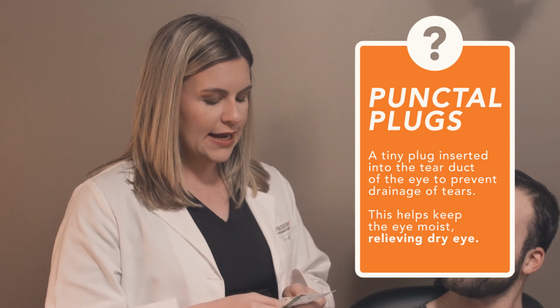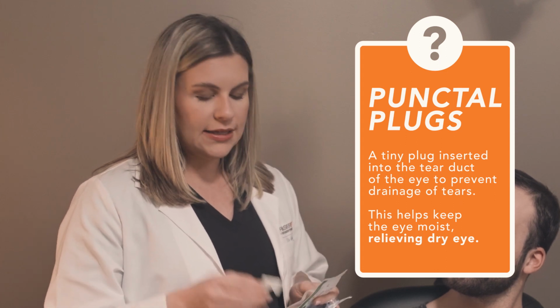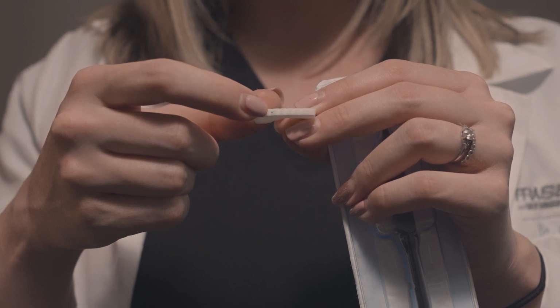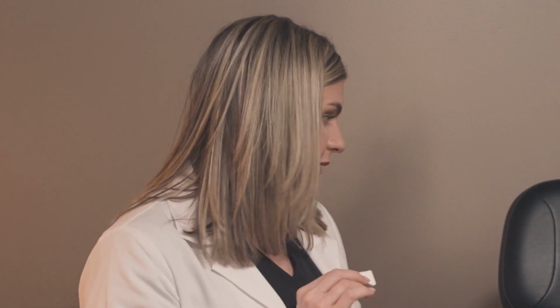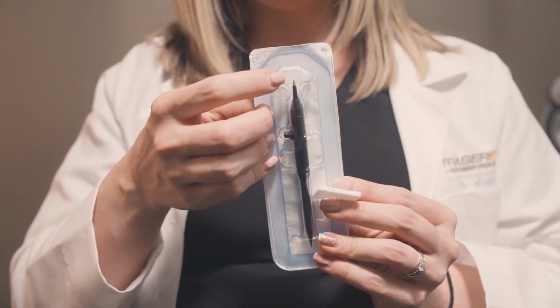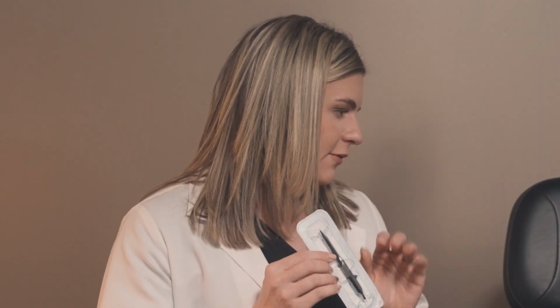There's two different kinds. So this one here is a collagen punctal plug, and it is teeny tiny. And these ones typically last about 2 to 3 months, and then they'll go away. If you have more severe dry eye or we're looking for a more permanent option, then we'll use a silicone punctal plug, which looks like this. The plug portion, again, is just at the very bottom. This whole thing is just an inserter. And this is permanent, but it's semi-permanent. We can remove it at any time if patients feel like it's uncomfortable or it's rubbing or irritating.